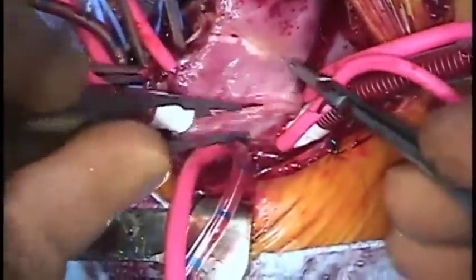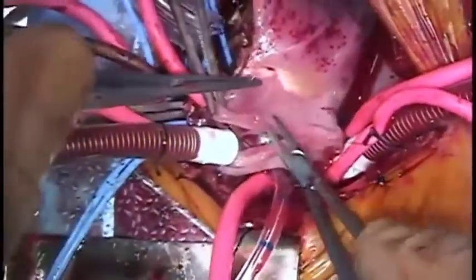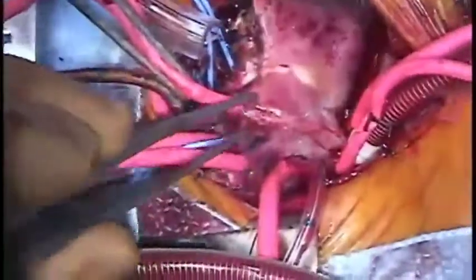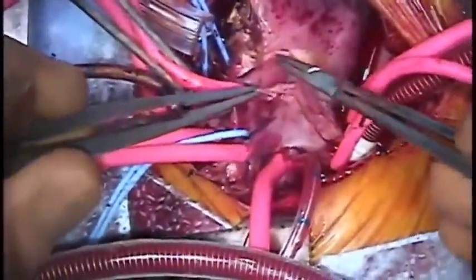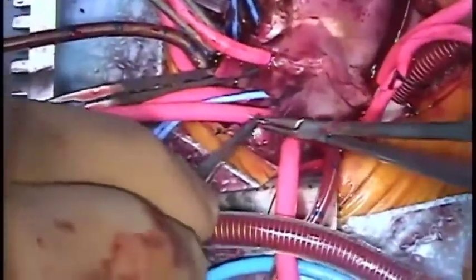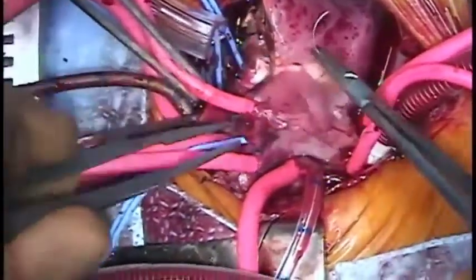The right atrium is then closed using a two-layer technique. The first layer of backwards and forwards sutures is very rapid. Once this layer is nearly complete, the flow is reduced and the SVC cannula is clamped and removed. The SVC is snared, allowing the first layer of sutures to be completed. The SVC is then opened and full bypass is re-established.